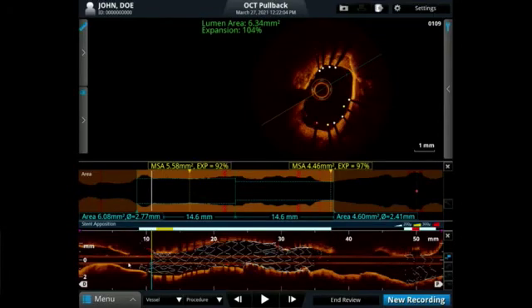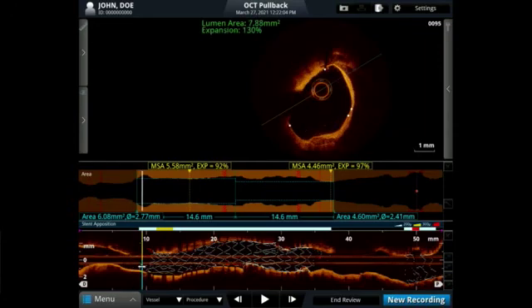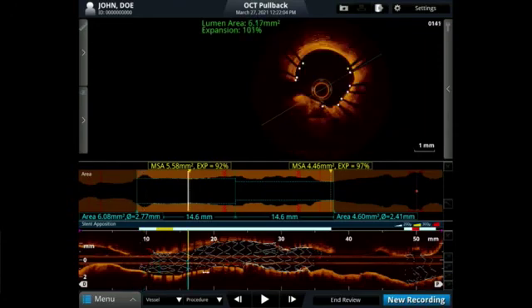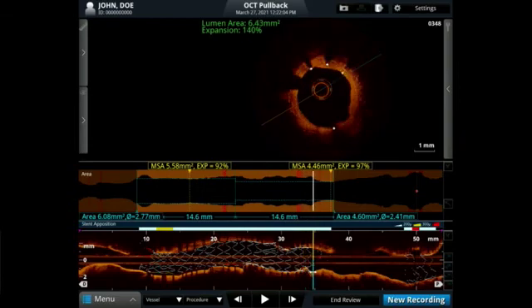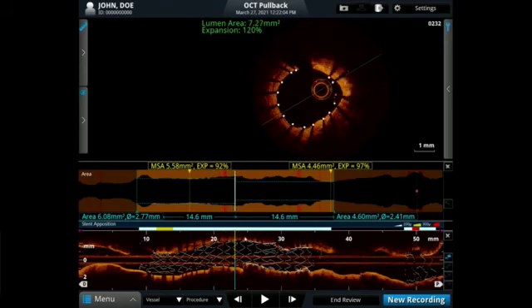Hey, look at that. All I care about is the distal edges. This edge of the stent, there's no dissection. I move quickly to the other, which landed in the old ISR. There's nothing here. And then our lesion was somewhere right there, probably. You can see the nodule cracks. Exactly, this is the nodule. Beautiful. So probably our lesion was here.